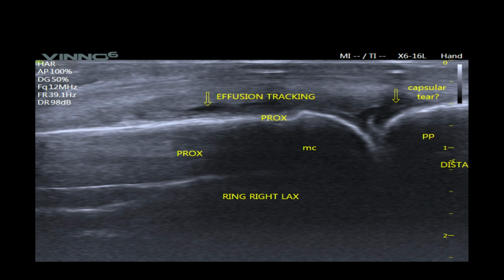We're not going to be covering the extensor anatomy. If you look at the referenced YouTube video at the end from Fajardo, ultrasound of the finger, that's a fantastic reference. So there's a few examples of some injuries that you can see in fingers. Hopefully you found the case studies interesting. Now it's actually time for you to give it a go.